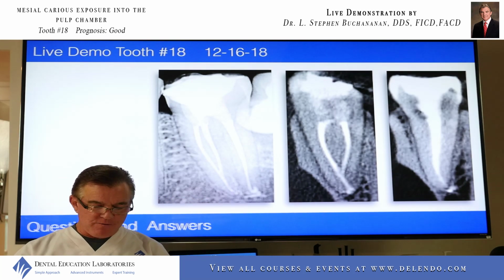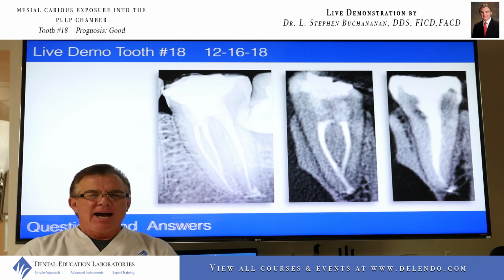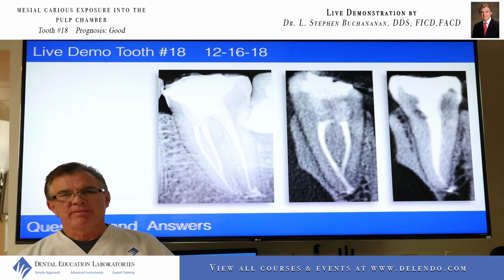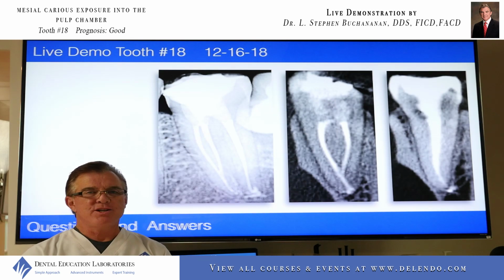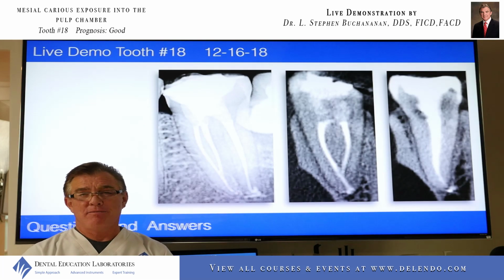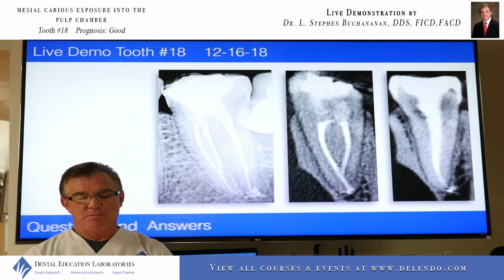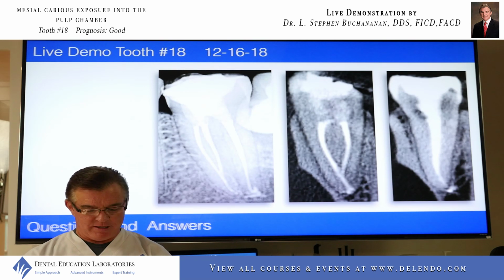The final sizes. What were the final sizes you shaped all canals to in tooth number 18? I did tooth number 18. I dedicate that case to actually Tom McClammy because I did it as per his exact instructions. He's been leading the pack on this minimally invasive shaping, minimally invasive instrumentation run that's been going on with GentleWave. Really exciting. These cases, I've been teasing him. His nickname now for me is Walter Hess because his cases are so under-instrumented that they really literally look like Walter Hess models with all the little kinks and irregularities that we saw in his replications of the anatomy.